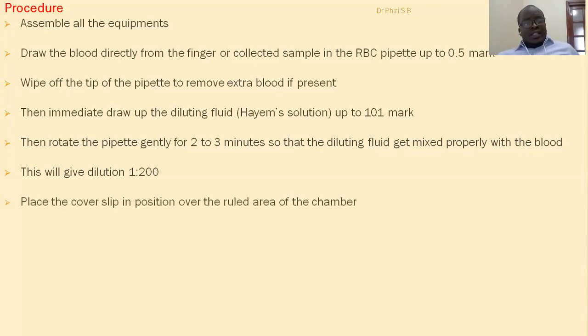Then before you charge the Neubauer improved chamber, you need to place your cover slip in position over the counting area of the chamber. So you put the cover slip on top of the chamber. For the cover slip to stick on the Neubauer chamber, you can put a bit of saliva on the edges of the cover slip so that it sticks on top, or you can use methylated spirit. You just put it on the edges, and it will stick on top.